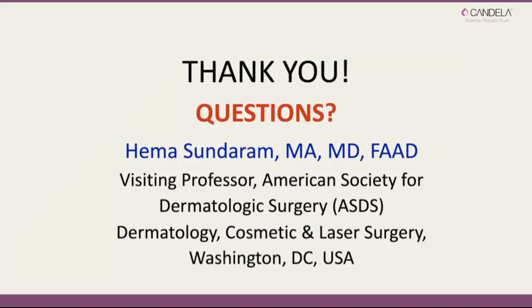So if we go to our dermatology journals, to our laser medicine and surgery journals, we will see good studies on these devices and good data that we can use as a reassurance to ourselves as to the efficacy and safety of the device, and we can also reassure our patients with that. So that's number one, that we need to look at the background of the device itself in terms of the evidence and the data and the publications. And we need to look at the company as a whole. Is the company focused only on selling, or is the company focused on a scientific, evidence-based approach?